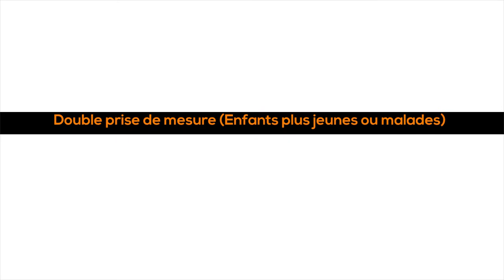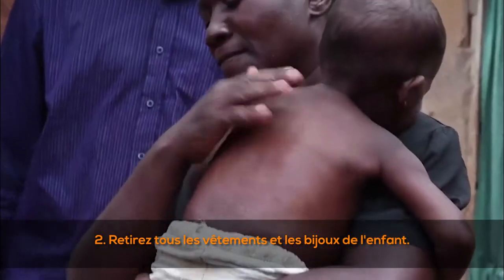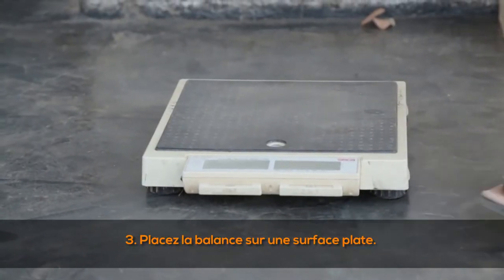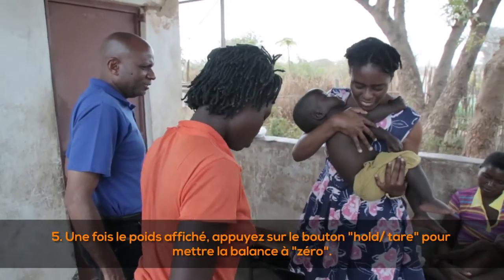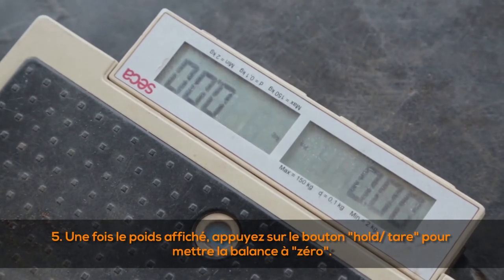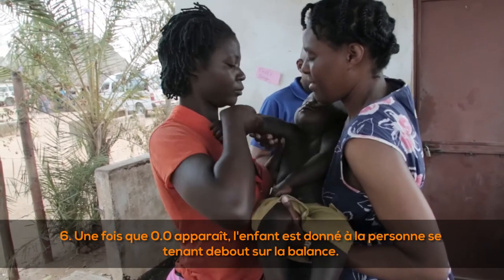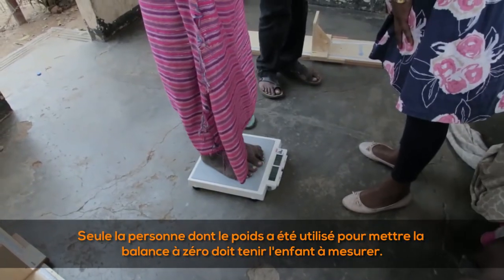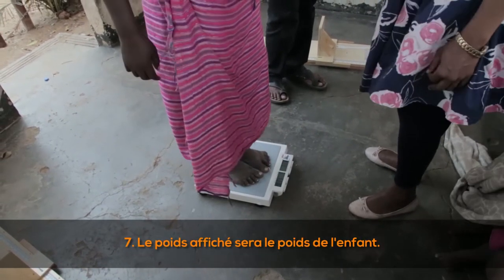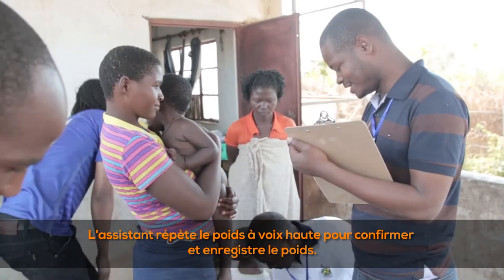For double weighing of younger or sick children: (1) explain the procedure to the mother or caregiver; (2) take off the child's clothing and jewelry; (3) place the scale on a flat surface and turn it on; (4) ask the mother or assistant to stand on the scale; (5) after the weight appears, press the hold or tare button to zero the scale; (6) once 0.0 appears, the child is given to the person on the scale — the child must be held facing the person and kept still; (7) the weight displayed will be the child's weight; (8) the measurer reads the weight out loud, the assistant repeats and records it.